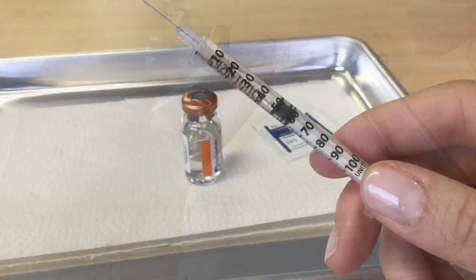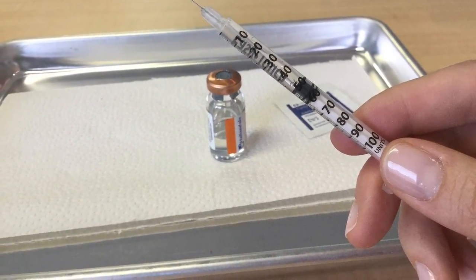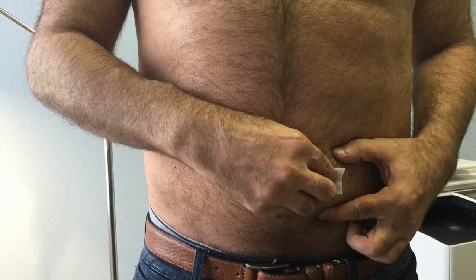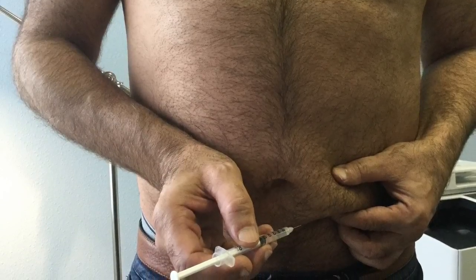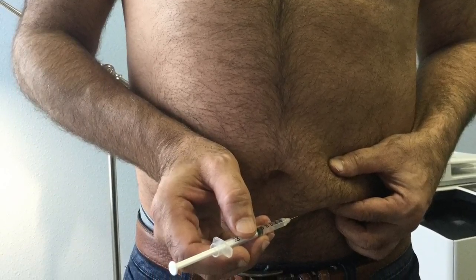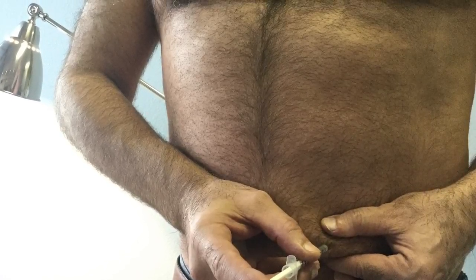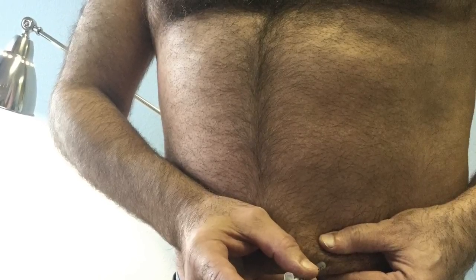Then you find the location where you will inject the medication. An inch on either side of the belly button usually works. You pinch a little bit of tissue there, you wipe it with an alcohol pad, and then you go ahead and inject the insulin syringe into your belly and push down on the plunger, which delivers the medication. Usually guys don't have any need for even a cotton ball or a band-aid, but if you do, have that nearby just in case.